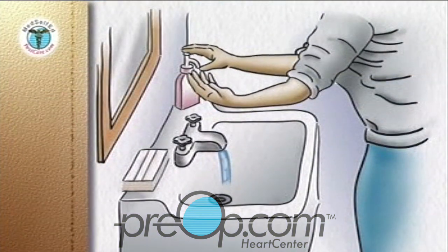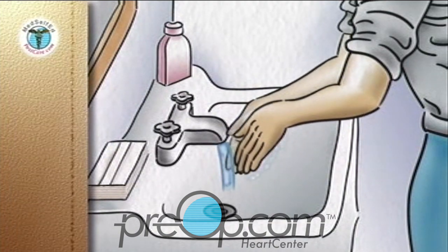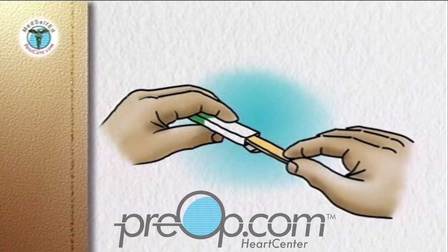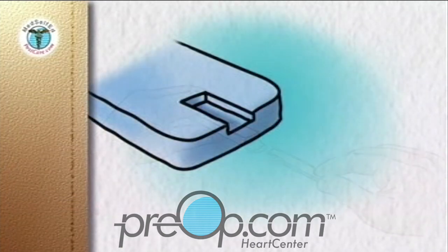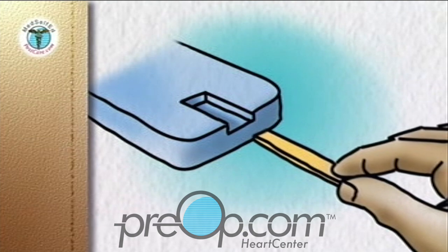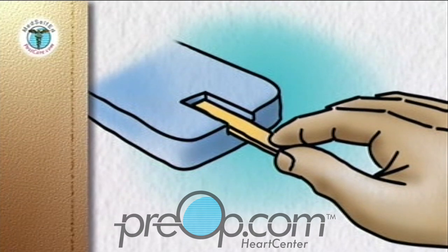Wash your hands vigorously with soap and warm water. Rinse and dry thoroughly with a paper towel. Remove the test strip from its individual package. With the meter off, insert the correct end of the test strip into the test slot of the meter, according to the manufacturer's instructions. This usually turns the meter on.